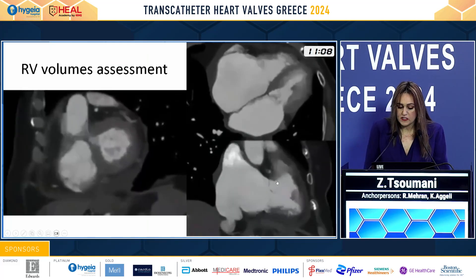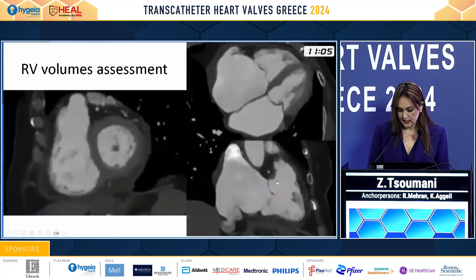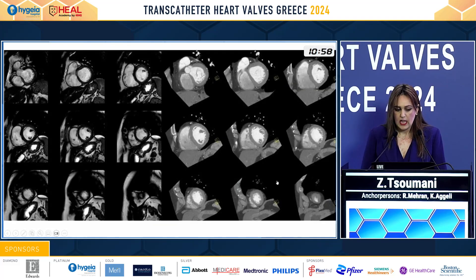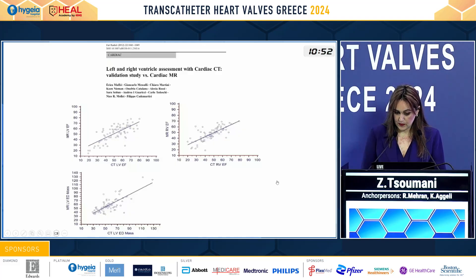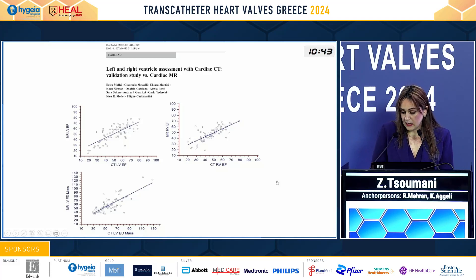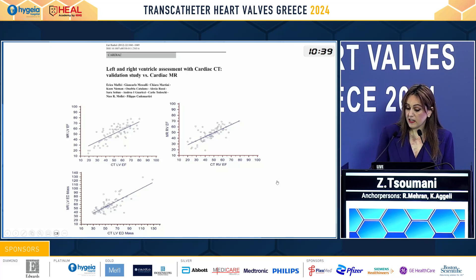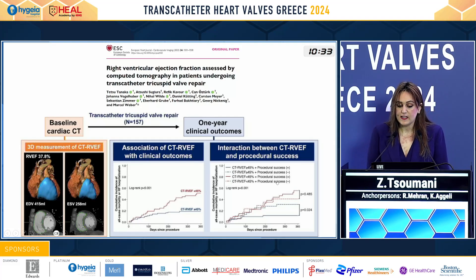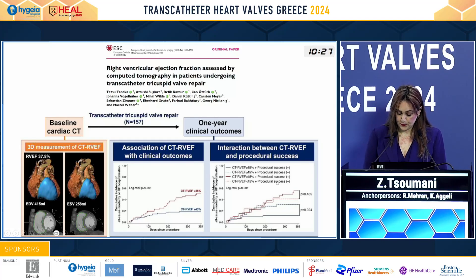We can even have cinematic images and assess regional wall motion abnormalities or septal motion. In a similar way as we do with echo, we can even perform a volumetric analysis. The values that we get with cardiac CT have been extremely well validated and correspond to those obtained from cardiac MRI. The right ventricular ejection fraction assessed by CT or MRI is an important prognostic predictor in patients with tricuspid regurgitation.